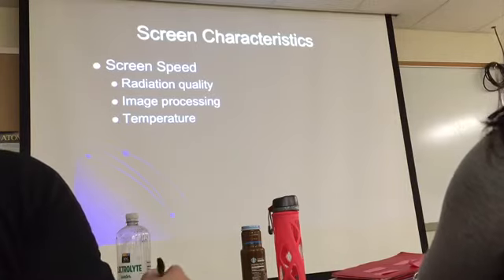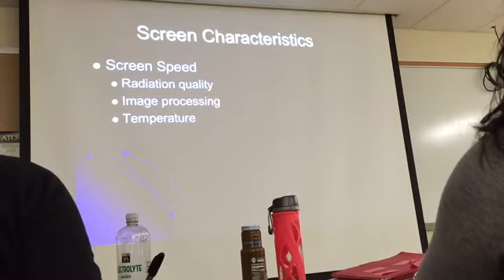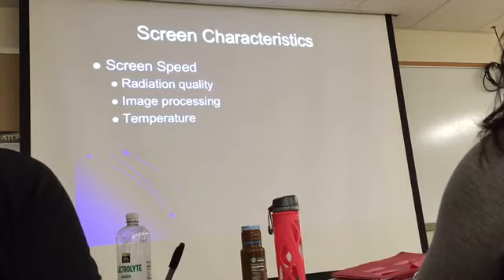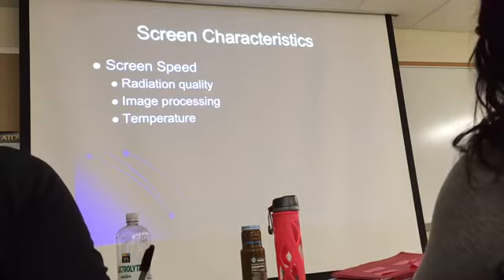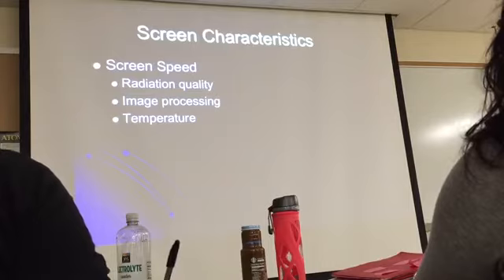But when you went into the darkroom, there was only one type of film. So when you open it, they look the same, but they are different. So can you tell me which one is slower, which one is faster? The extremity is the slower. But same film. It just makes it easier.